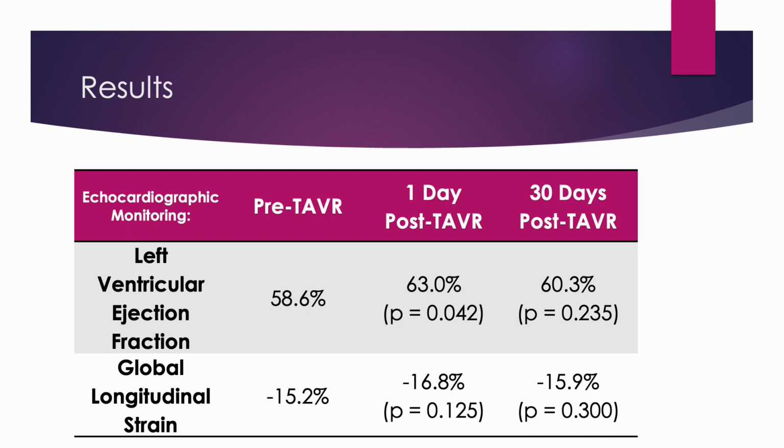The global longitudinal strain did not show a statistically significant change at 1 day, going from negative 15.2% at baseline pre-TAVR implantation to negative 16.8% post-TAVR implantation at 1 day, then at 30 days going to negative 15.9% post-TAVR.